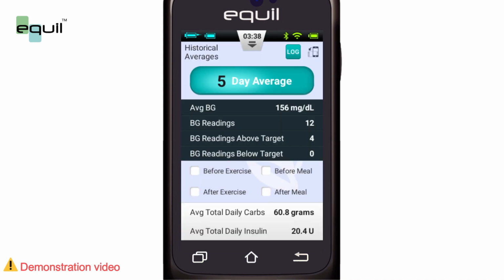At the bottom of the screen, you can choose different filters to show, for example, the averages of all readings that were taken before, after exercise, or before, after a meal.